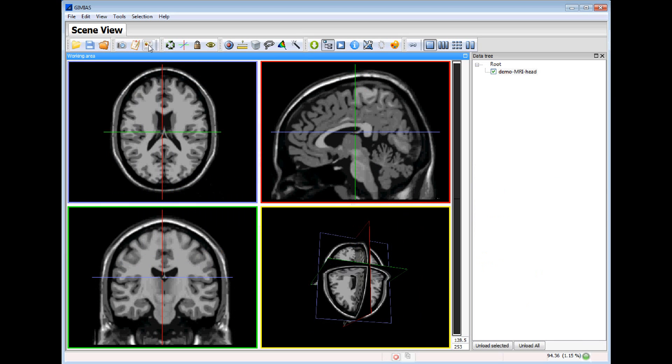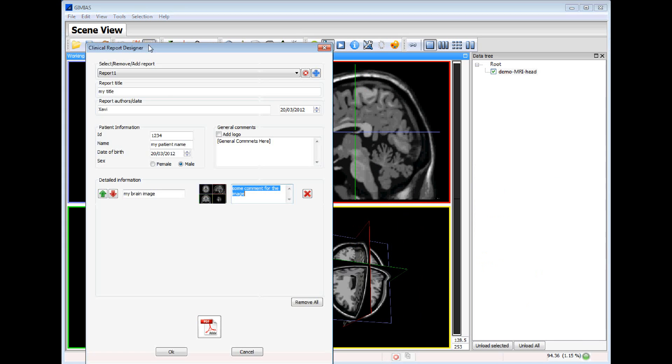We open the clinical report designer. We will see the detailed information. This is the image we captured.